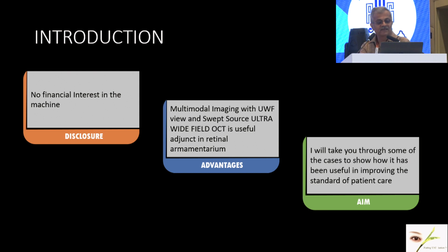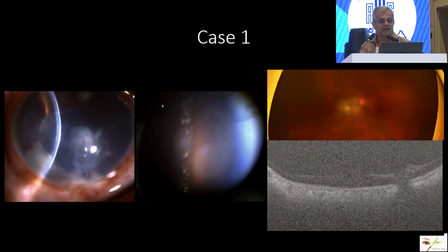So basically, this is a useful adjunct in the retinal armamentarium. It's not a must, but it's a valuable tool. I'll take you through some of the cases to show how it has been useful in improving patient care.